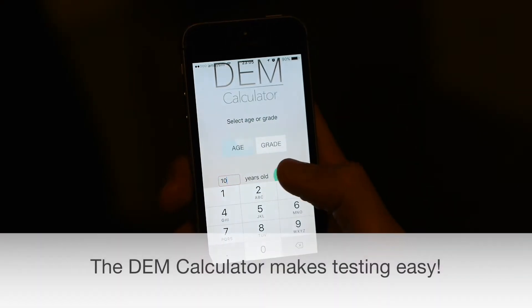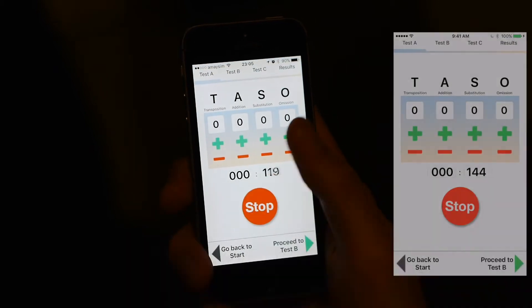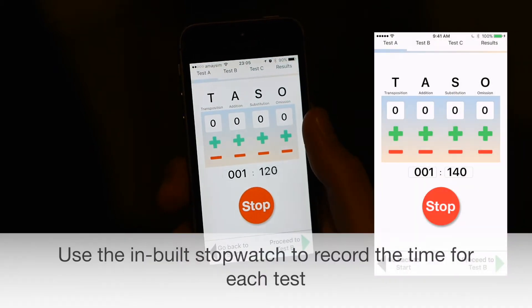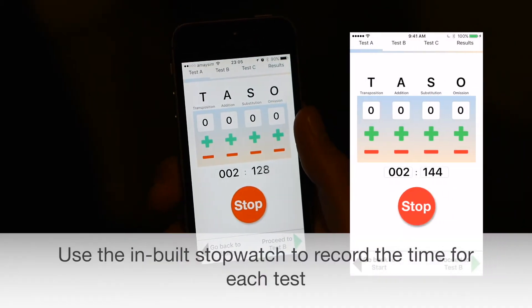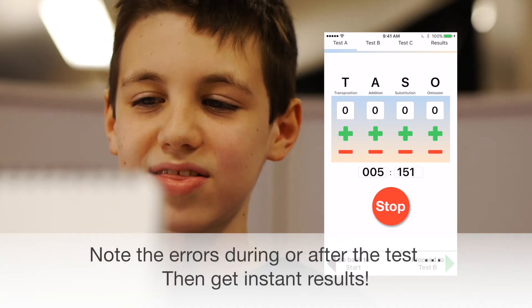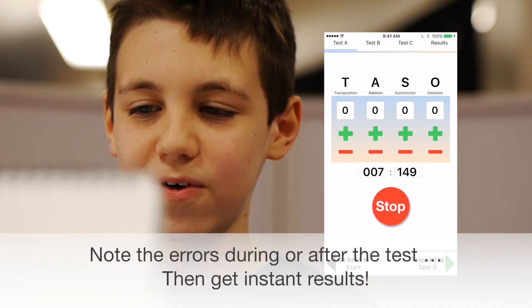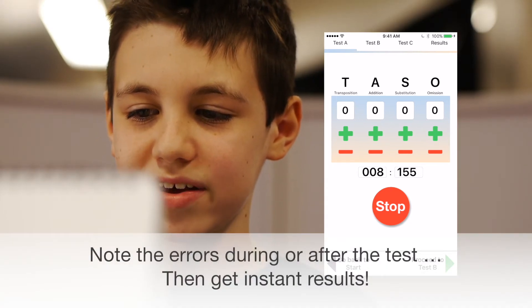The DEM Calculator makes testing easy. Use the inbuilt stopwatch to record the time for each test. Note the errors during or after the test. Then get instant results.